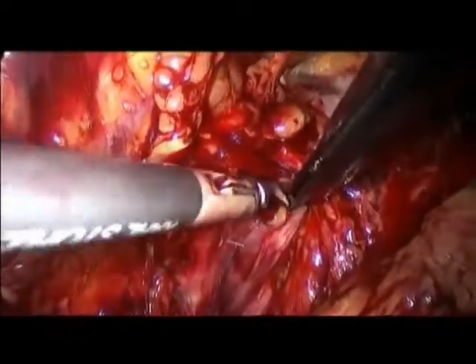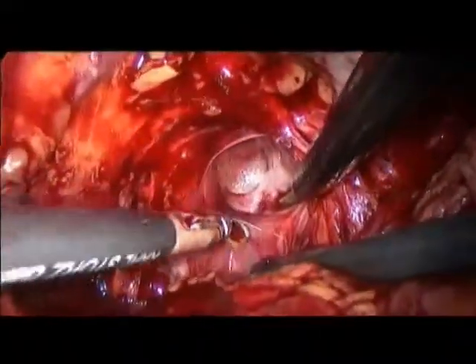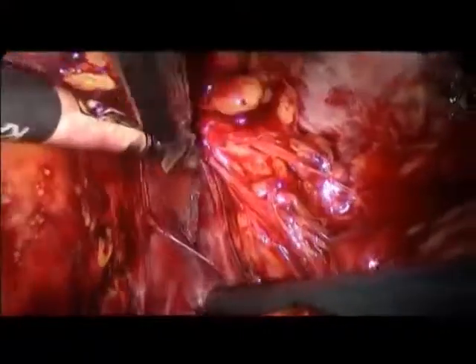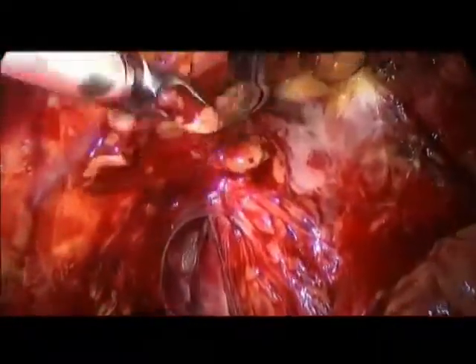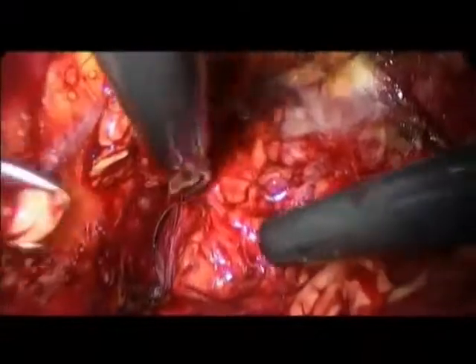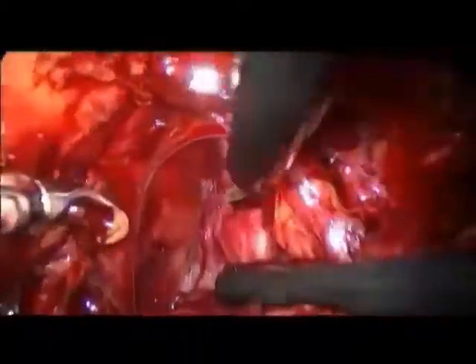And what we have on the lateral... But you are also now trying to keep the levator fascia on the muscle, yeah? On the muscle, yes. So you are not incising and it stays on the muscle. It's a combination of sharp and blunt dissection. It is aiming at the lateral... So it's interesting. You are no more incising just the endopelvic fascia laterally. So you are starting from the bladder neck more or less. Yes, because it's a place where it is easy to push away.